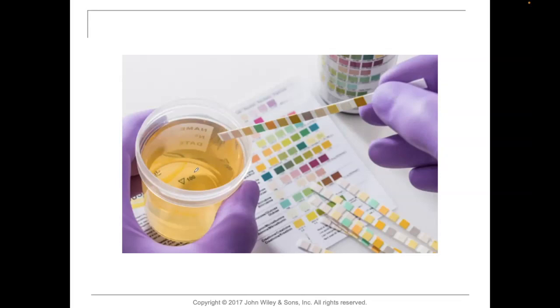We'll dip it inside and either manually inspect it to the key, or they'll run it through a little computer that will spit out a print up of everything that it's looking for.